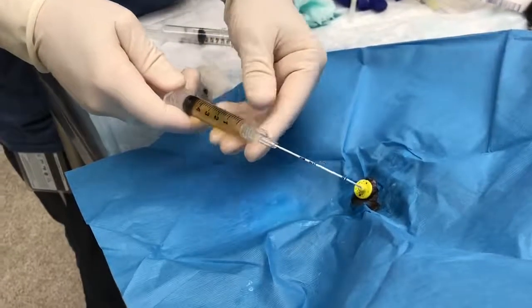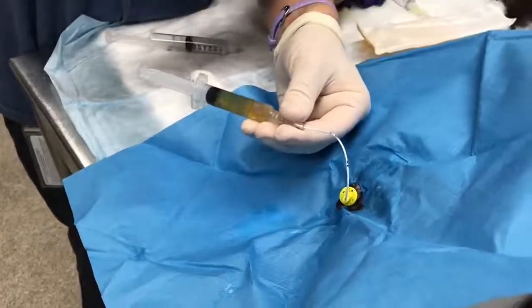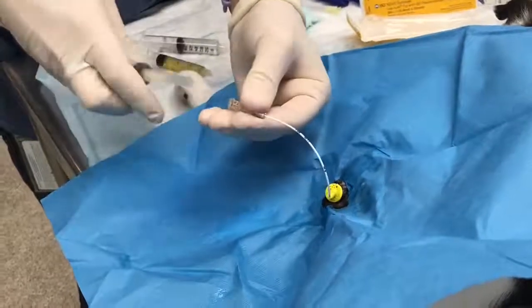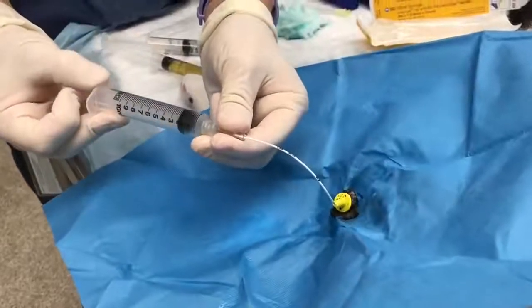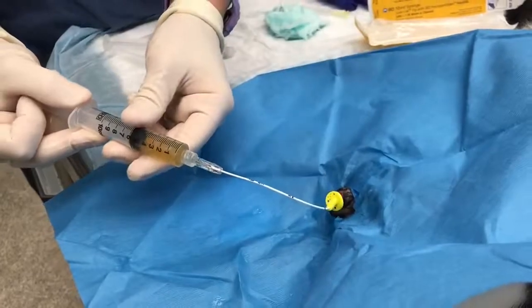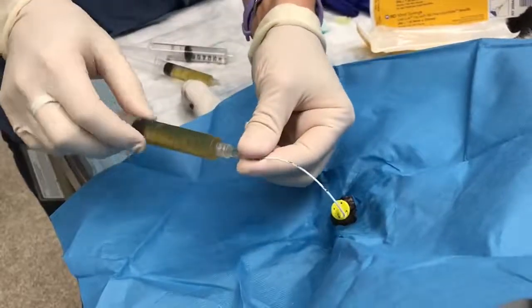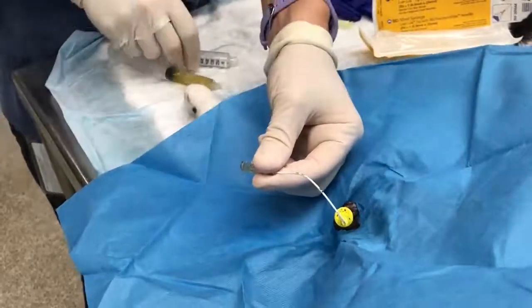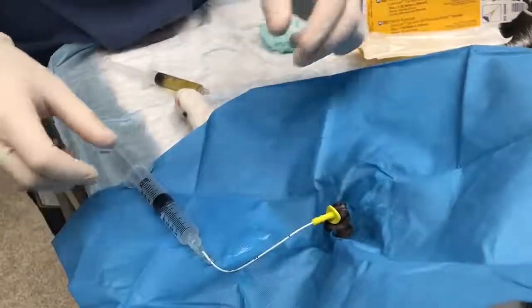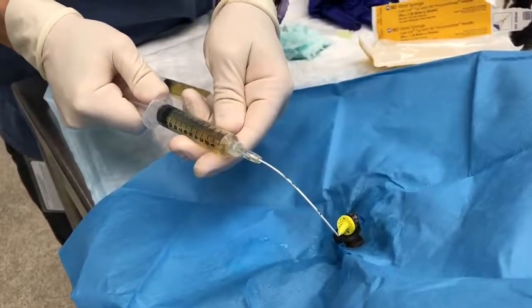Seen here, the urine is being removed from the bladder. The first urine sample should be discarded because it contains flush. A second urine sample will be more representative and should be safe for urinalysis and urine culture. Next, using your pre-made sterile saline flushes, flush the bladder copiously until no improvements in urine clarity or color can be seen.